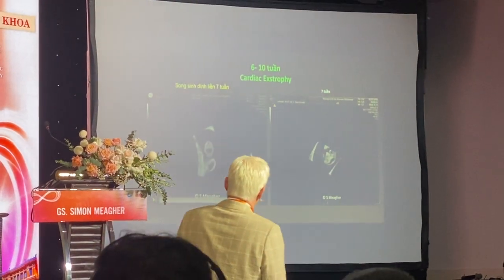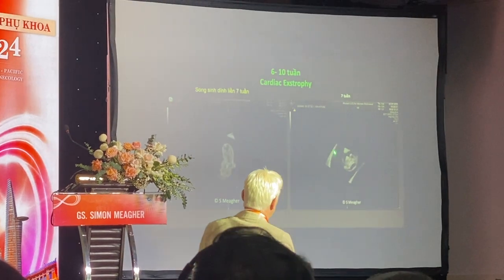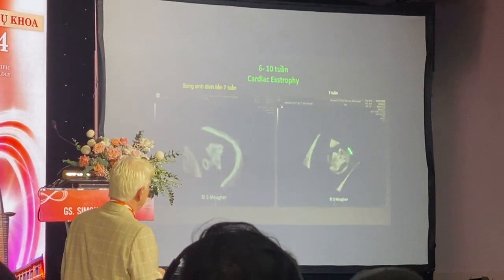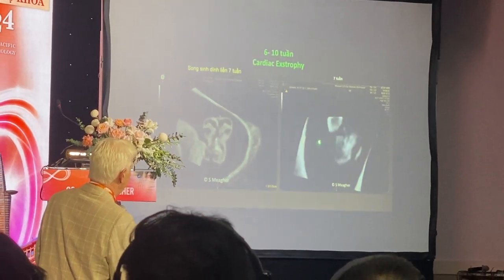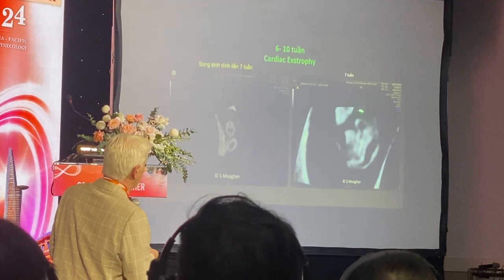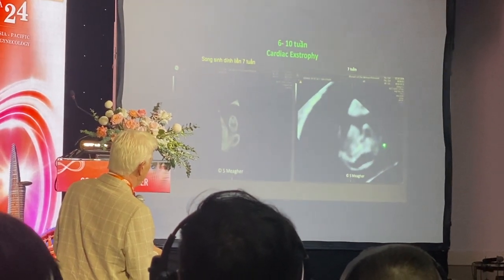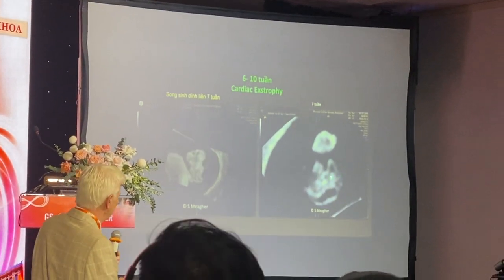If we look at this even earlier in pregnancy at 6 to 10 weeks, this is a cardiac abnormality in an embryo that measures 7 weeks and 6 days. And if you look at the cardiac pulsation, it's outside the embryo. And you will also note that there is no cranial end. The fetus has acrania and ectopia cordis. And this is as early as 7 weeks of gestation.